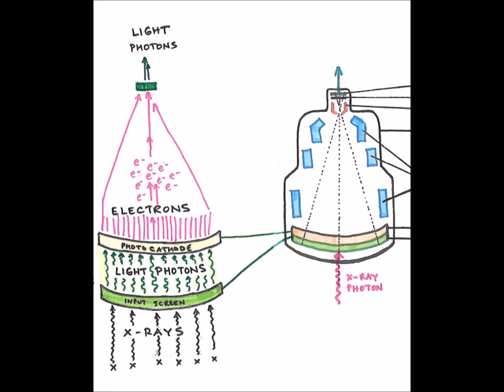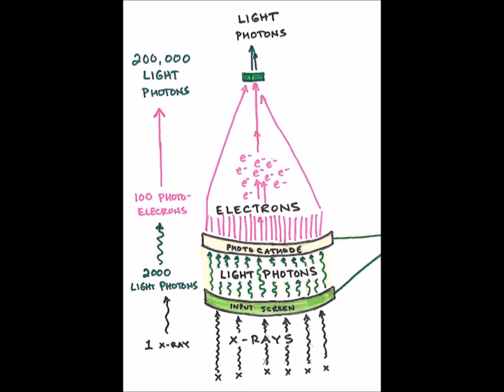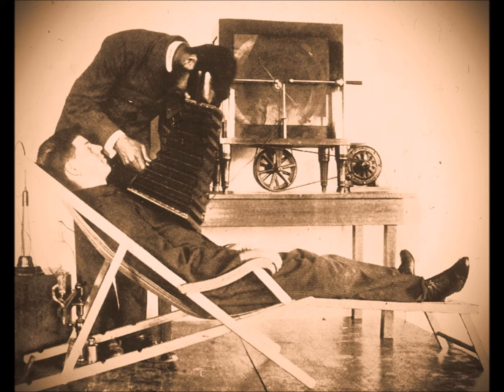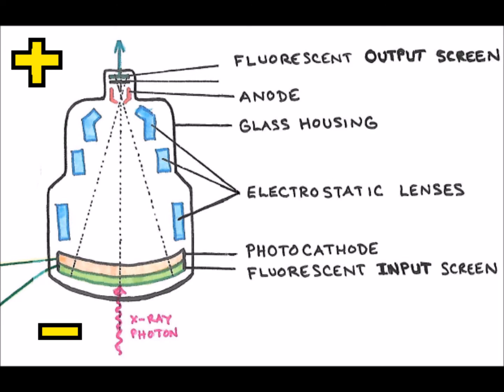Next stop is the photocathode. Hope you're not on information overload. It's connected to the fluorescent screen, which can clearly be seen. Both are concave to keep us on track, if you know what I mean. And now I'm converted from a light photon to an electron, but let's continue on so we don't lose our pace. I see nothing but electrostatic lenses in my face, all with similar charges like me.